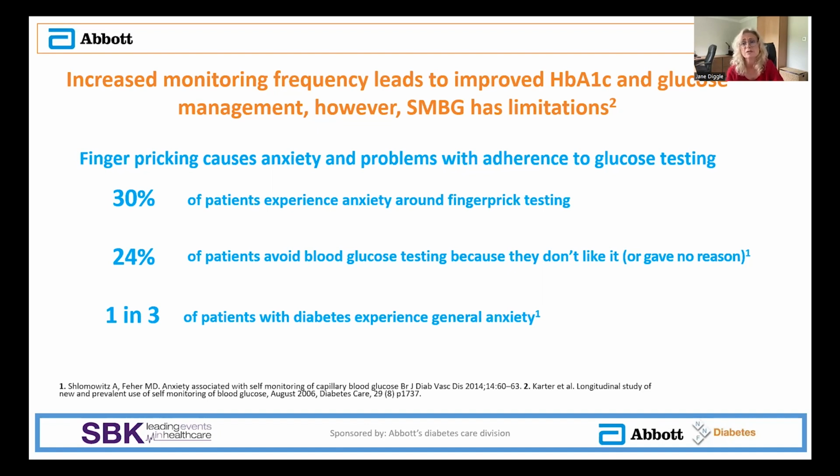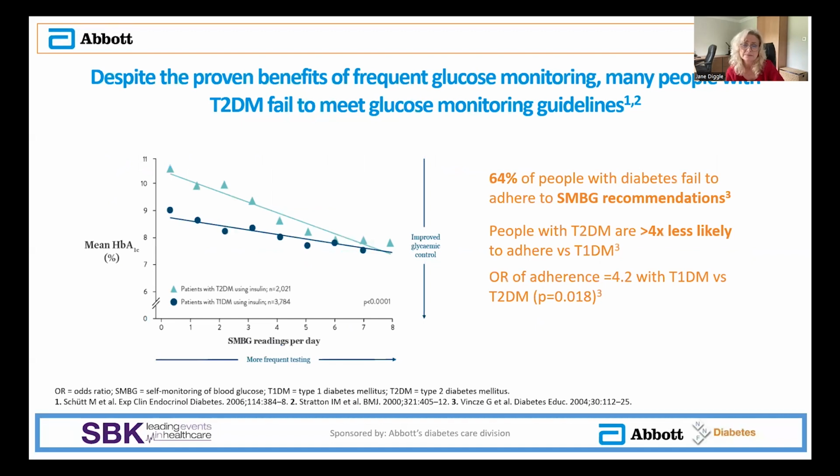It can contribute to feelings of anxiety, and it can be a real struggle. And in fact, what you can see here is around 25 to 30% of people experience anxiety around fingerprick testing. And up to a quarter of people will try to avoid doing it because they don't like it. And I think if we were to put ourselves in that position, I know myself, I would really hate to have to do this. So if we move on to the next slide.